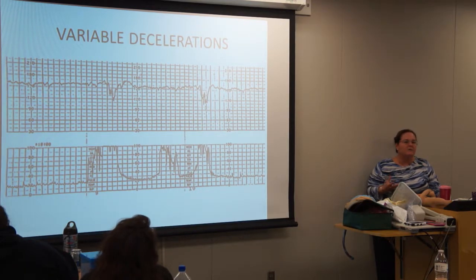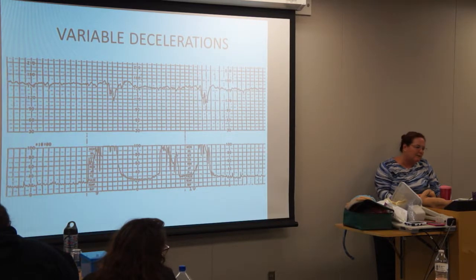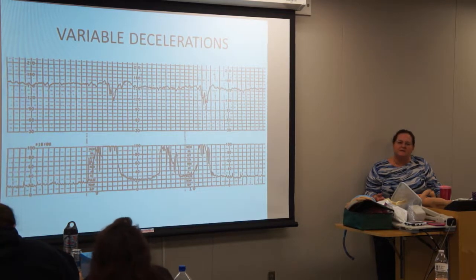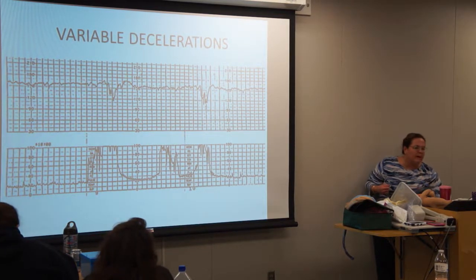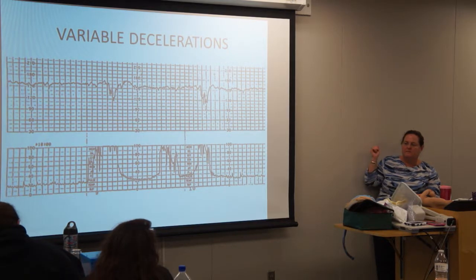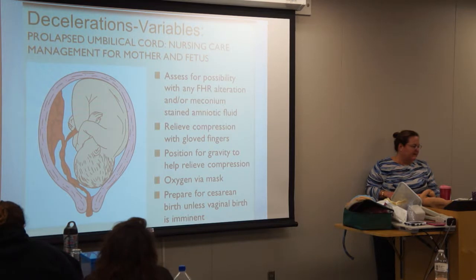So if you have a variable during pushing, meaning delivery is probably fairly soon, you may not be as concerned, because you'd almost expect it. Because now, if they're about to deliver, that cord is already stretched the maximum amount that we were given, you know, at the creation of time. I'm not sure I said that right. Okay. Questions about any of that?